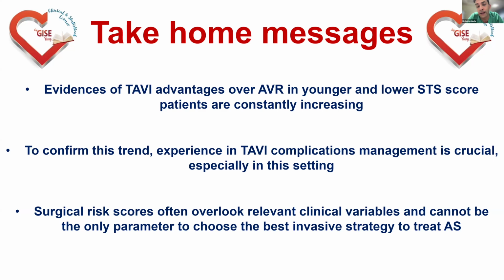If you are able to achieve 15 years of durability of the valve, you have a great success. But if you have to perform a TAV in TAV after 8 or 9 years, I don't think you are happy because you still need a third intervention during the life of this patient. So it's very important to take into account patient prosthesis mismatch, which is important also in older patients, but it's more important in this type of population.